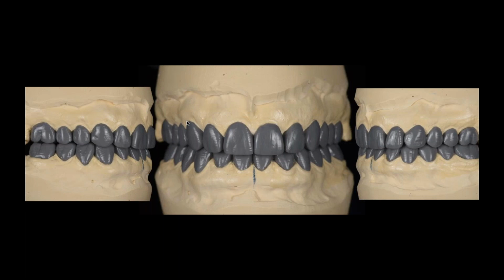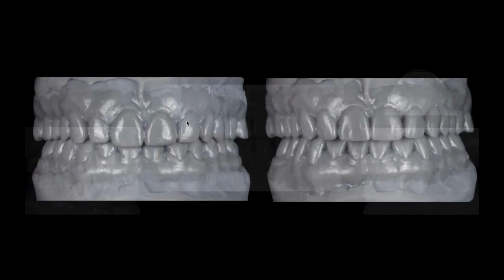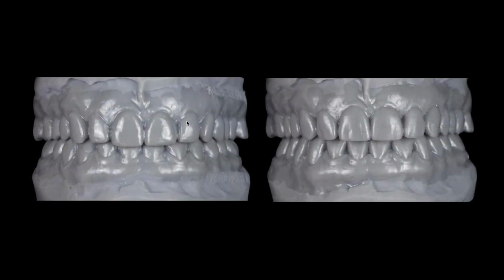So what we actually wound up doing was, after we did our manual wax-up, we scanned the wax-up and turned that into a digital file. So now what I have in space is a digital pre-op and a digital post-op. And I have the ability now to send those back to the patient and the doctor for them to look at and evaluate. And I like this aspect. I'm sure most of you are thinking I should do it in white, and I have no problem if you want to do it that way. But most of my doctors are used to seeing the gray because of the detail and textures and so forth.